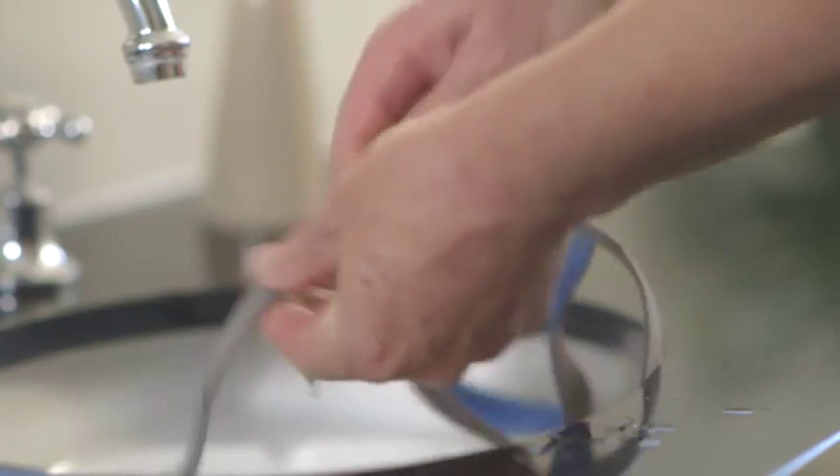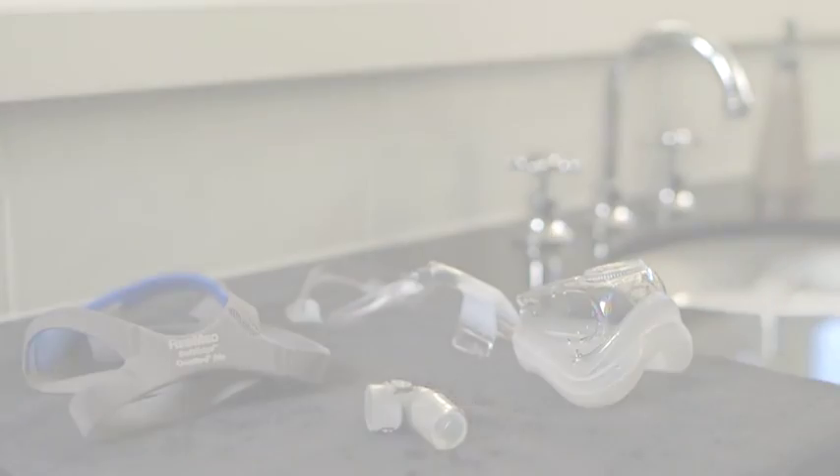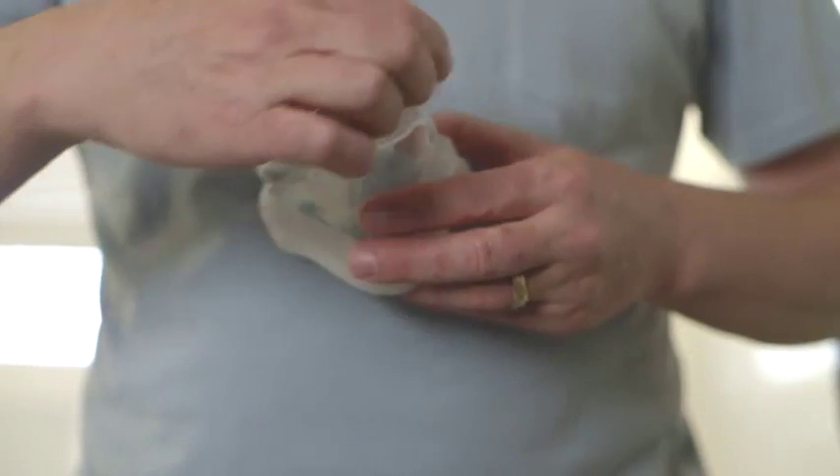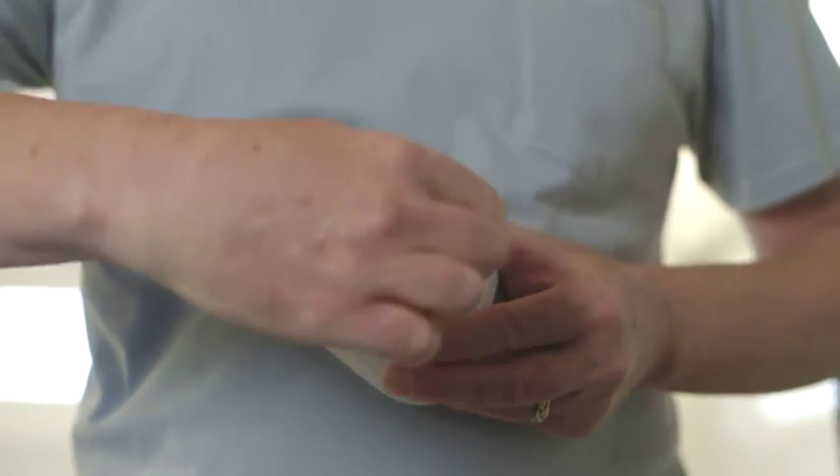Clean your headgear the same way, once a week. Then air dry completely, out of direct sunlight. If the vents or the elbow require more thorough cleaning, then also use a soft bristle brush.